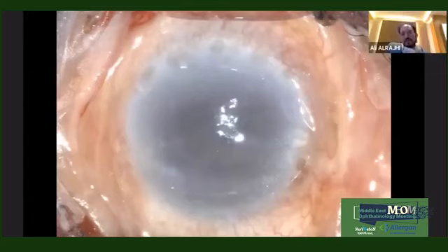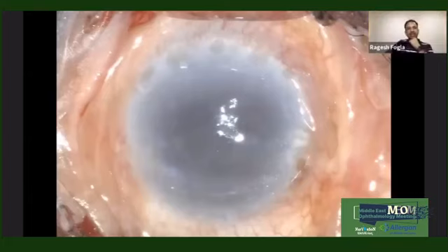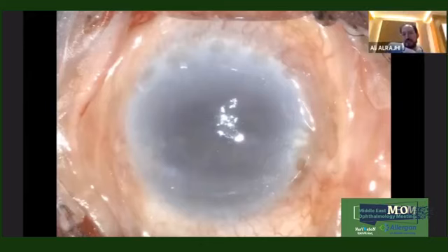We face this frequently because this is obviously trachomatous scarring. Correct. And older generations that we have here in the kingdom, many patients face this. It depends on the degree of corneal opacification, if he has a combined corneal edema, and so on. Sometimes we don't make the decision unless we dilate the pupil under a slit lamp.